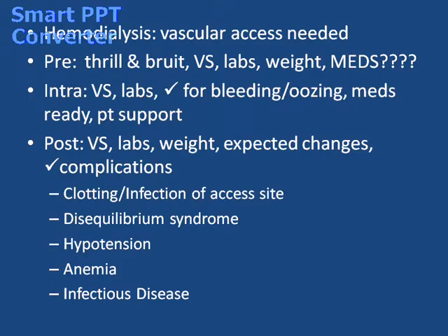Your patient needs to be instructed about the procedure. Often you're going to run into these old wily dialysis patients that have been doing it a long time, but they typically are done 3 times a week in 3 to 5 hour sessions, and 2 needles are inserted, one into the artery side and one into the vein side.